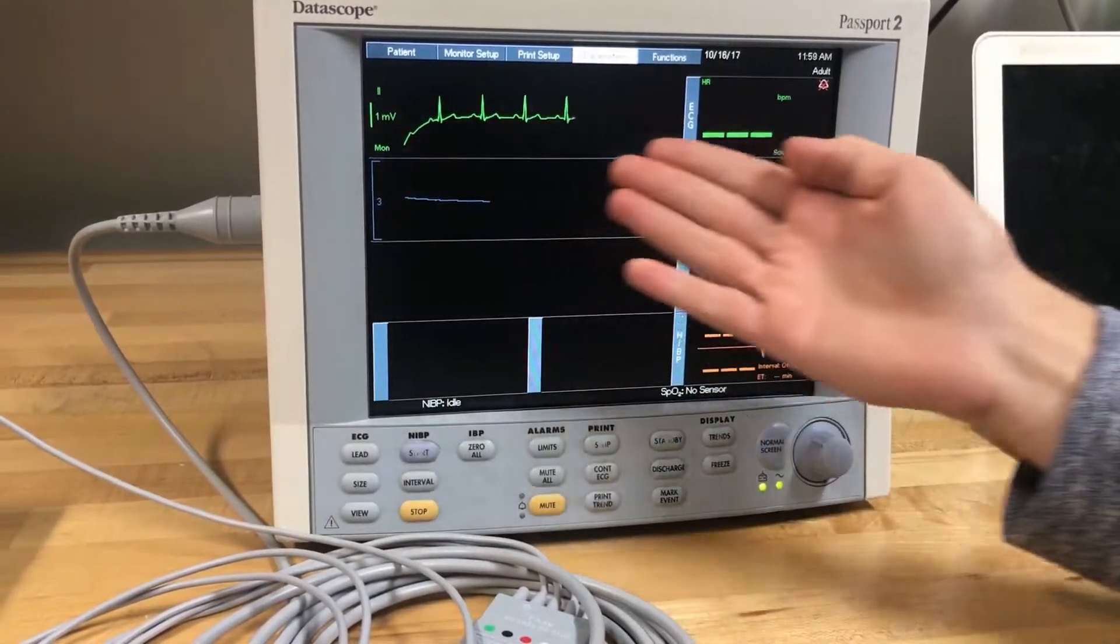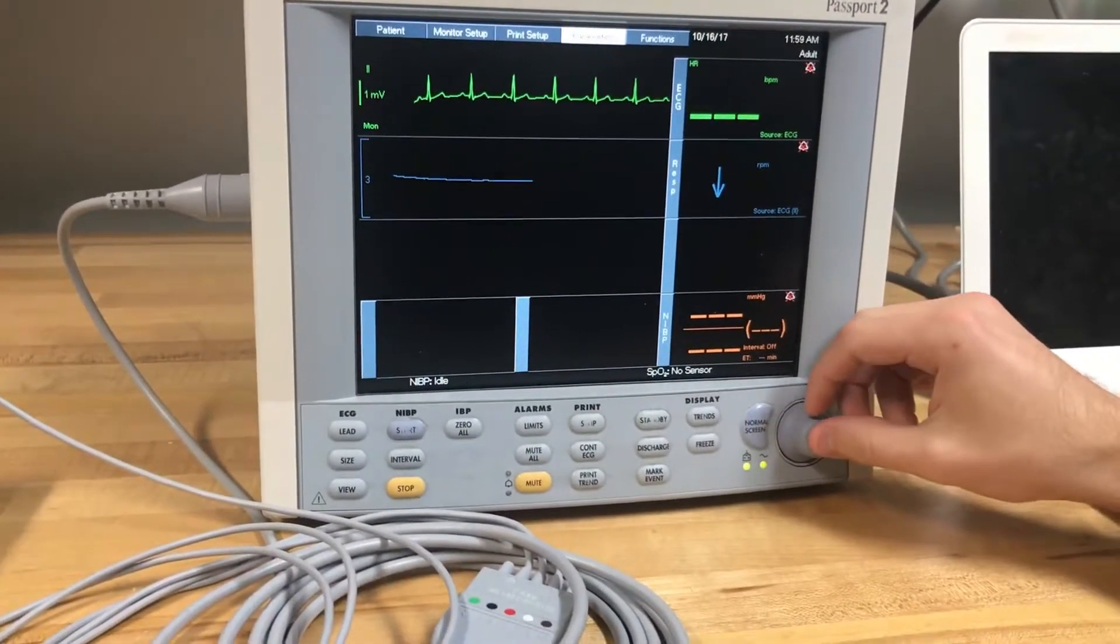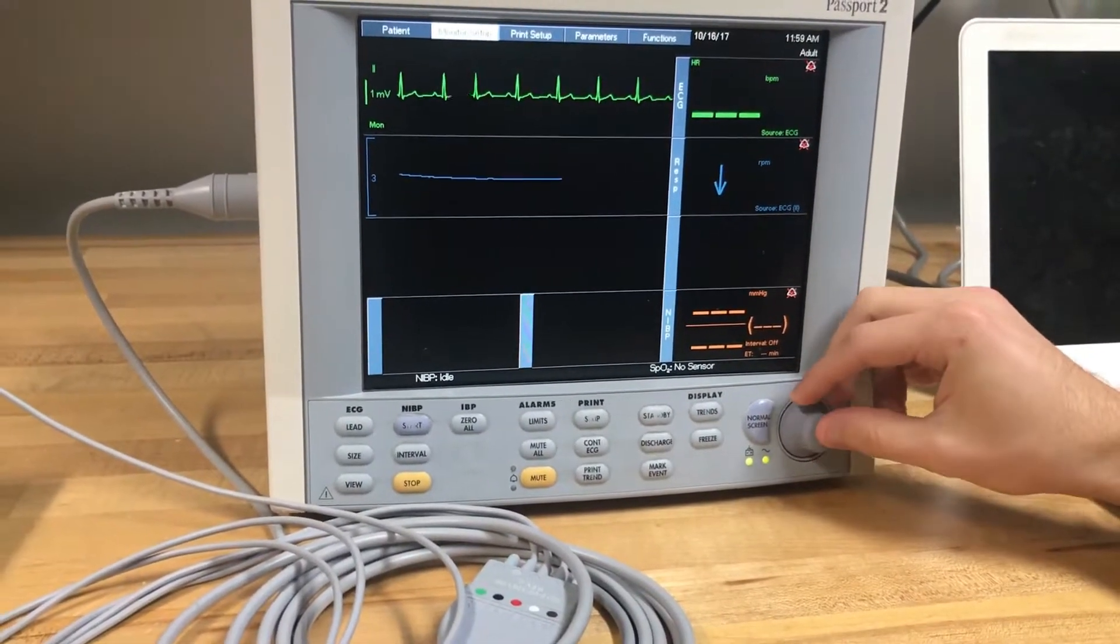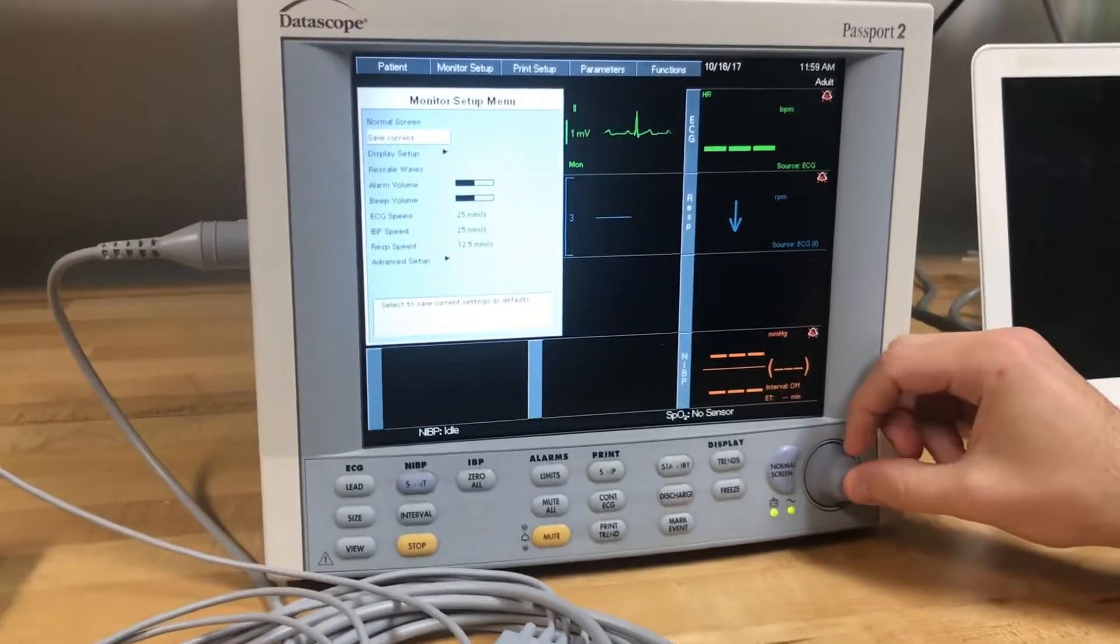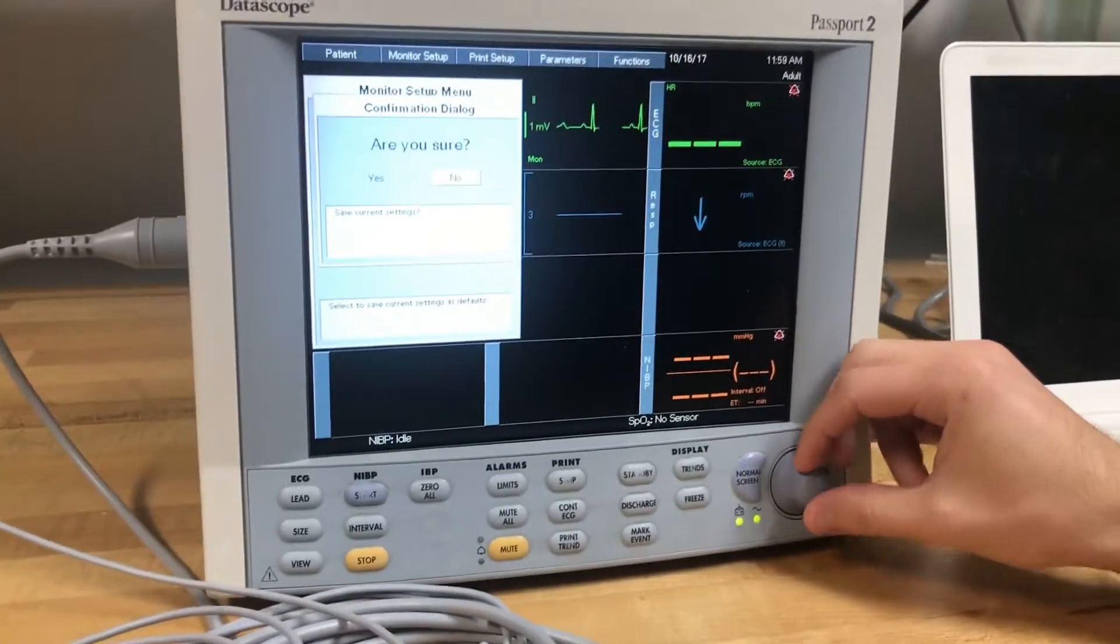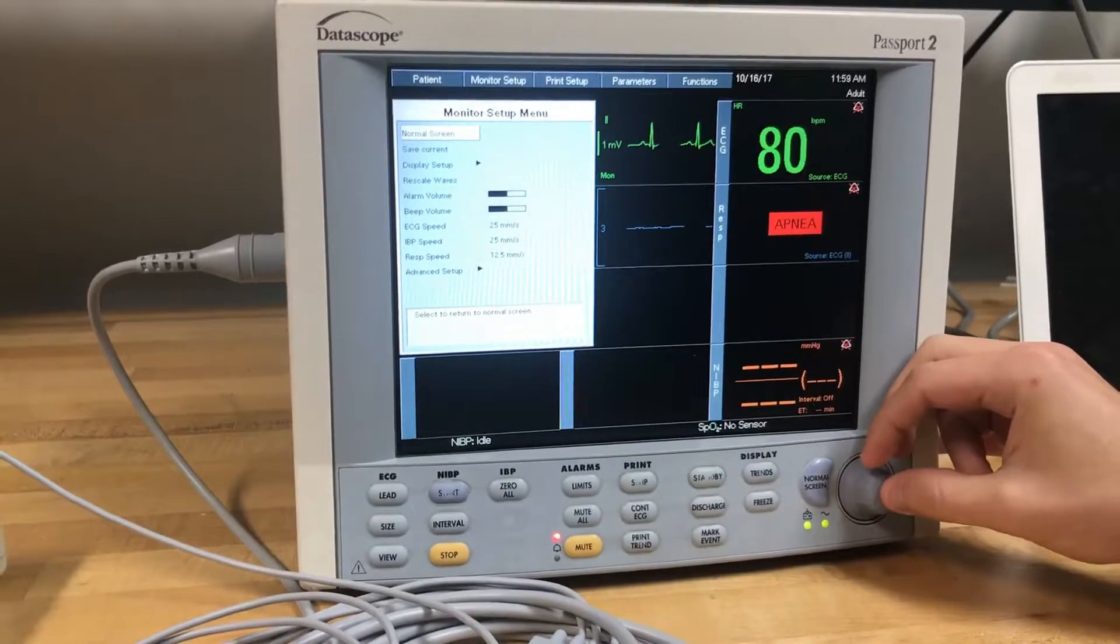To save this setting, scroll over to monitor setup and hit select. Scroll down to save current and select it so that your monitor will now boot up in the correct setting.